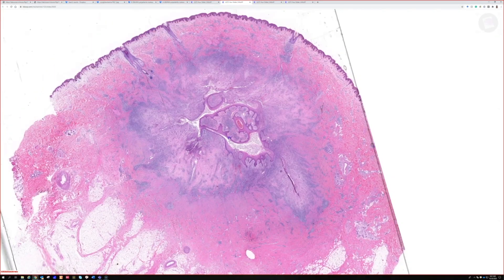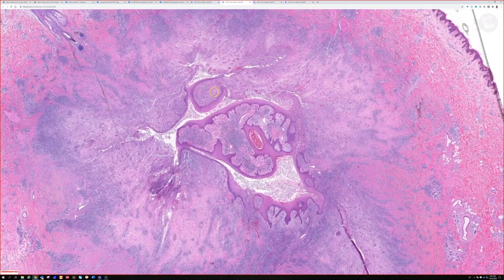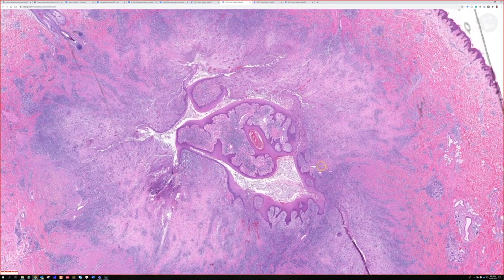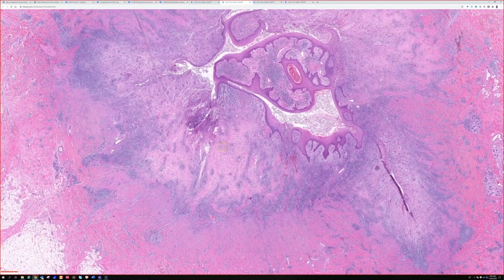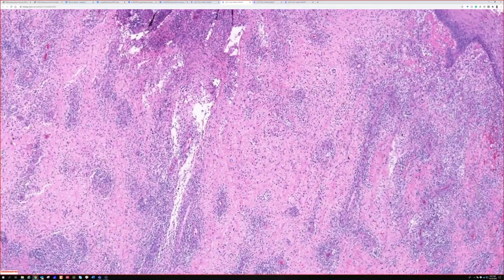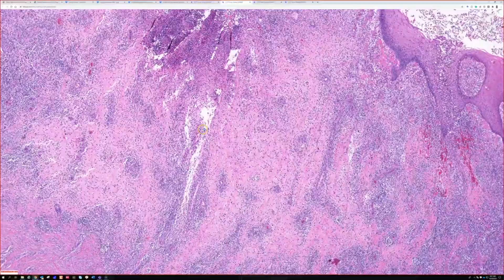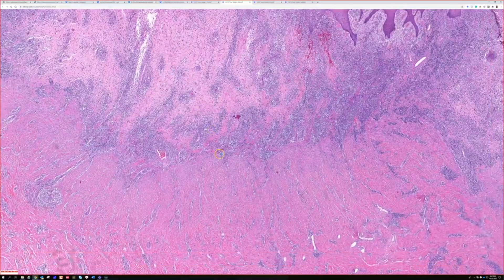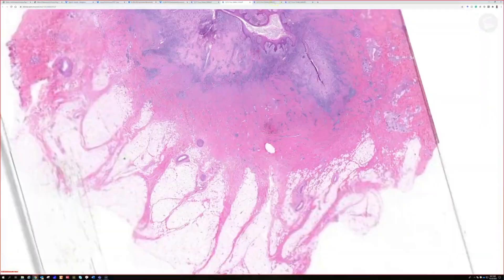I have another example pulled up here. This is hidradenitis suppurativa. Again, it's kind of like a complex cyst. I find one of the helpful things is there's usually abundant loose granulation tissue. And even if you don't have a true cyst lining, you'll have these pseudo cysts that are formed in the middle of this very edematous granulation tissue. And usually because it's a chronic recurring process, there's a lot of scar in the background.